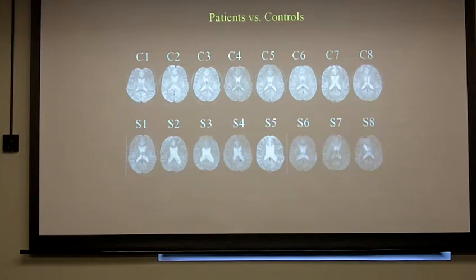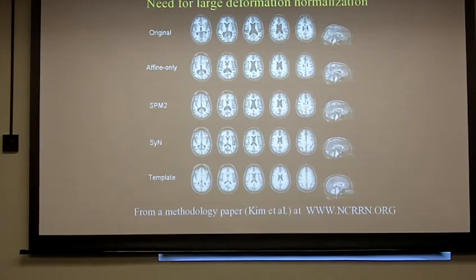So, the point of this slide is that the same thing applies to the functional images too. It impacts your functional MRI data too, not only the structural MRI.